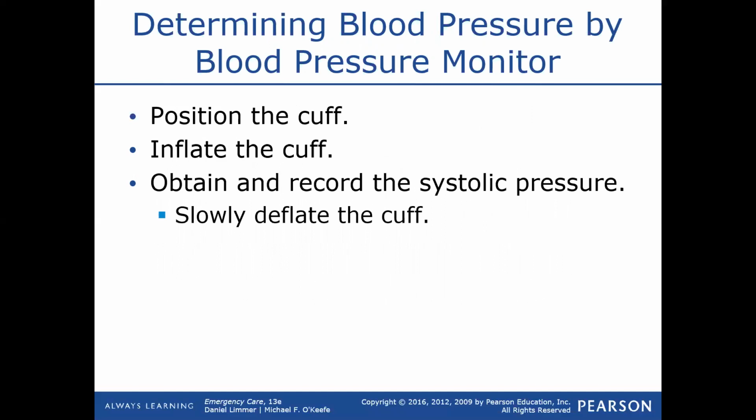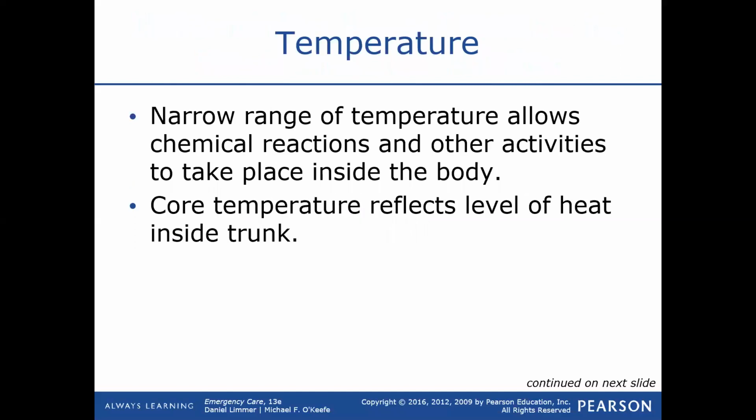Determining blood pressure by blood pressure monitor. So you've got these $40,000 LifePaks that are in some of your ambulances. They're kind of nice, but again, they're a high quality tool, but they're still a tool. We should always be taking at least one manual if we have a monitor. We put the cuff on, push the button, it inflates, and it tells you what the blood pressure is. But a lot of movement will screw up those machines too. So you might get a number that looks way off. You're like, I don't know if I believe that. Check it manually, because those machines can get a false reading.